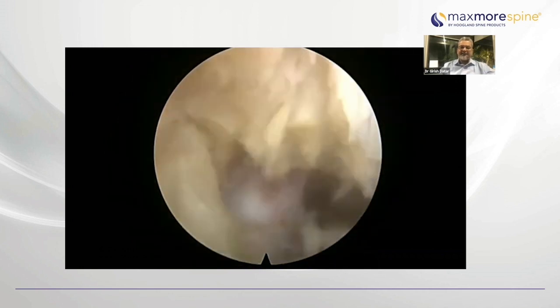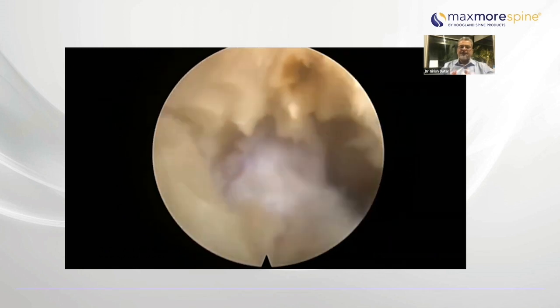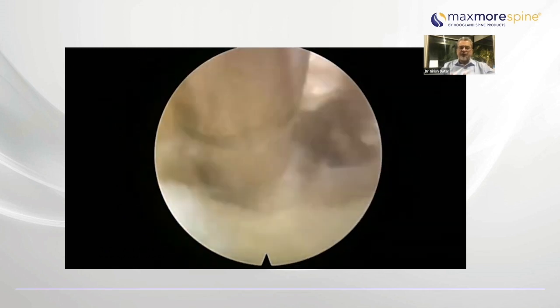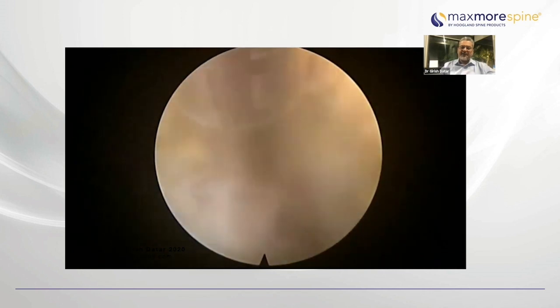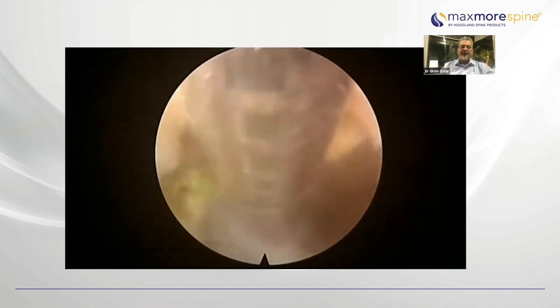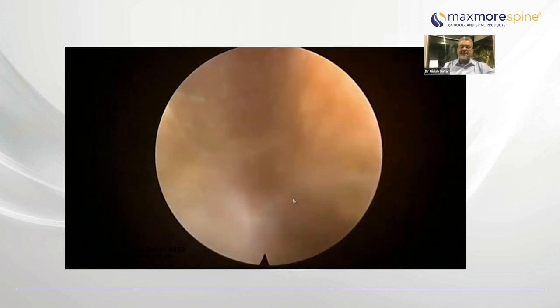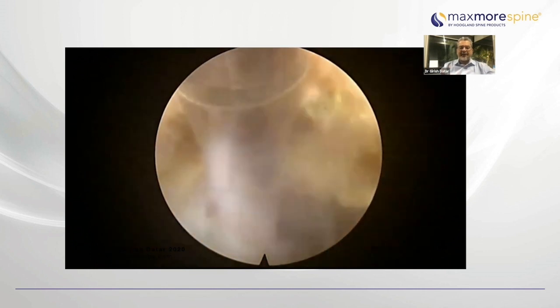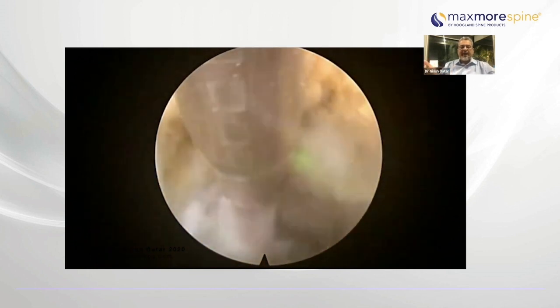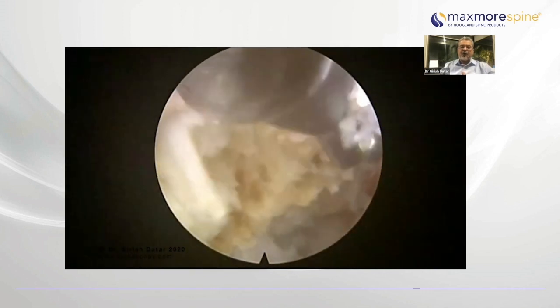And third, in the stenosis pathology, there is going to be this mucoid degenerated ligamentum flavum, which is going to protect the root caudally. So once you have done the cranial part of the decompression, that is the axilla and the roof of the axilla, you will proceed the way you would do it otherwise. But caudally, once you have drilled it, you have already reached half of the caudal pedicle. You have already taken off a good amount of the lamina part of the superior articular process and the medial wall of the pedicle, which usually generates a sufficient amount of room there.